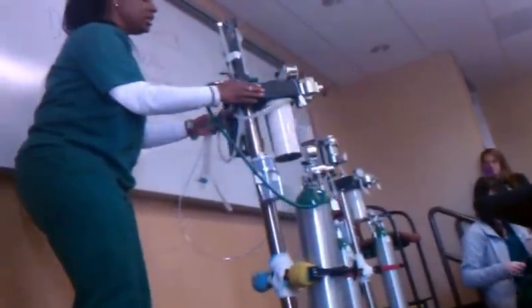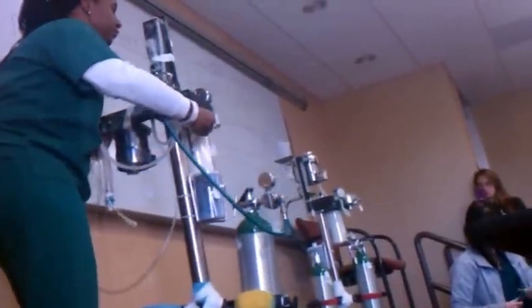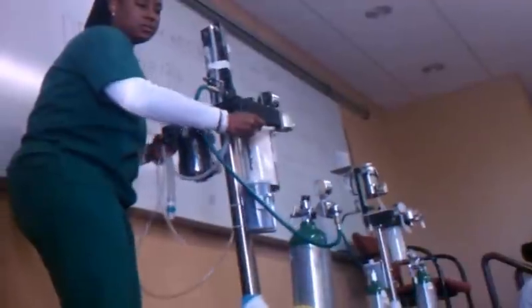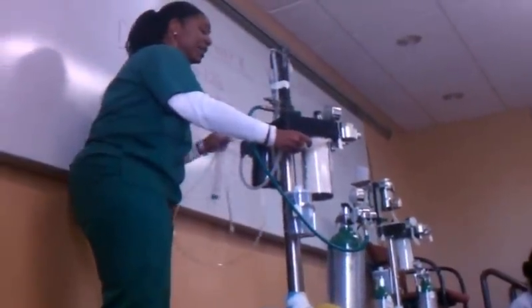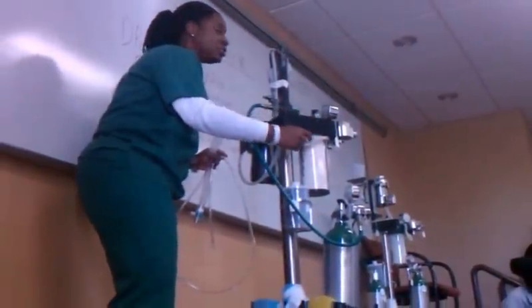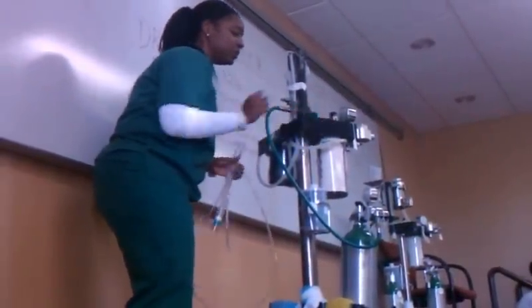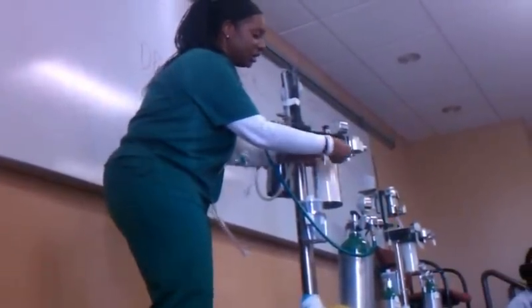On this machine, there is a port that's labeled fresh gas outlet. That means that's where oxygen and isoflurane are going to be delivered to the patient. This is where we have to interrupt the flow — what we do is we separate the fresh gas outlet, just unhook the port.